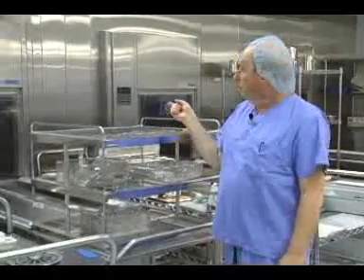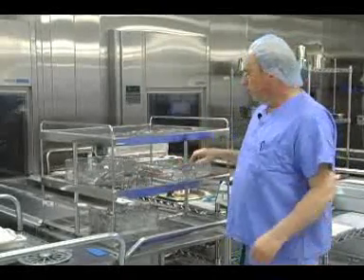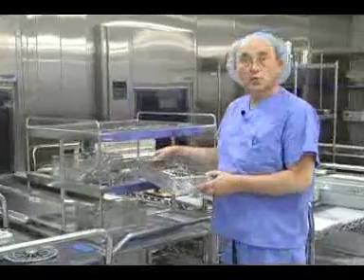When the dirty instruments are cleaned, it's basically like a dishwasher. It goes through the cycle just like your dishwasher would. They'll come out on a conveyor, and the clean instruments will be on a rack like this. Then we'll proceed from there after they cool.